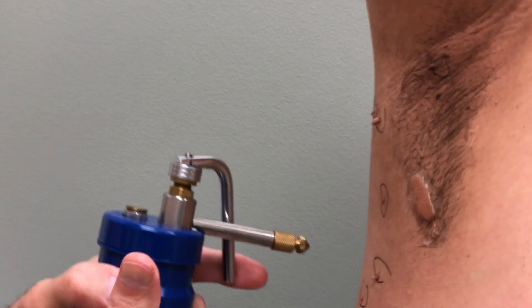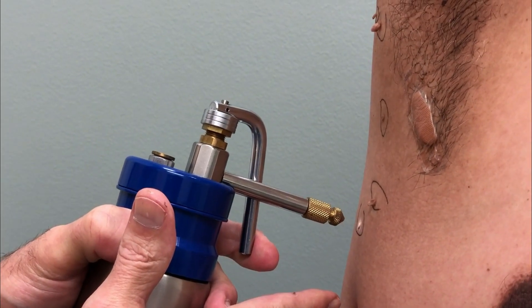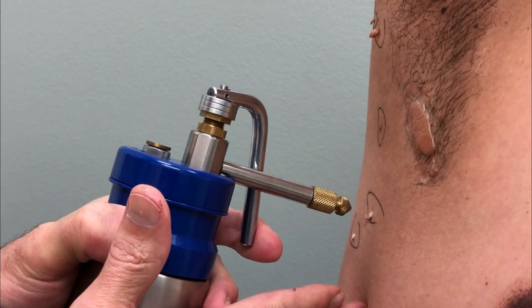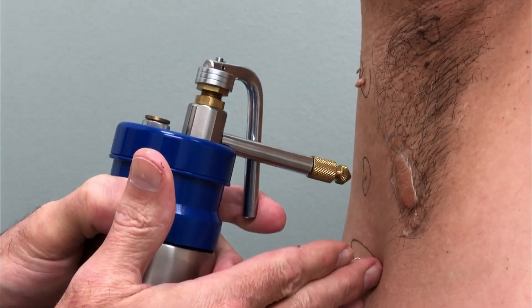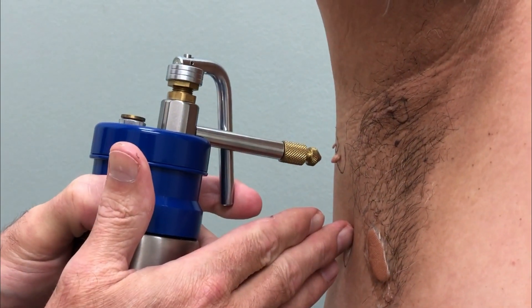It takes a few weeks — they'll heal up and be fine. Then you can come back and we can work on other places. You've got some other spots we're going to work on next time. Why did you come to our clinic instead of your old clinic? They didn't have an opening and my cousin switched to this one. We're glad to have you. All right, you ready? One, two, three.